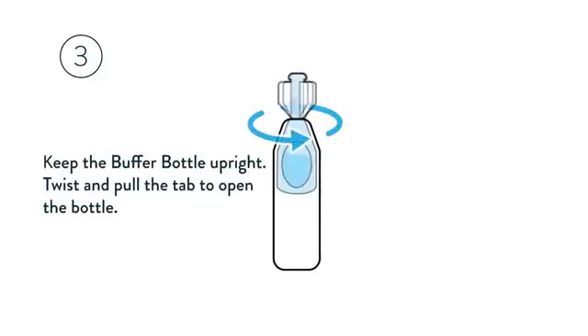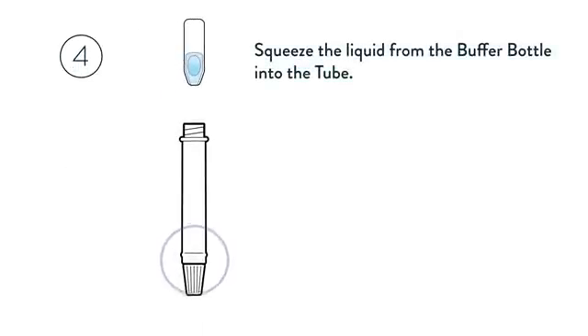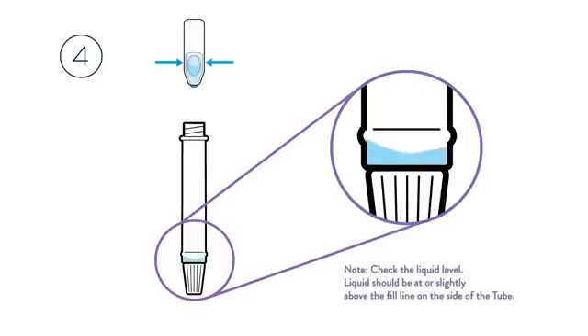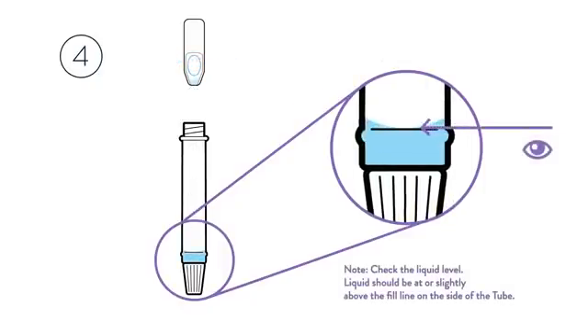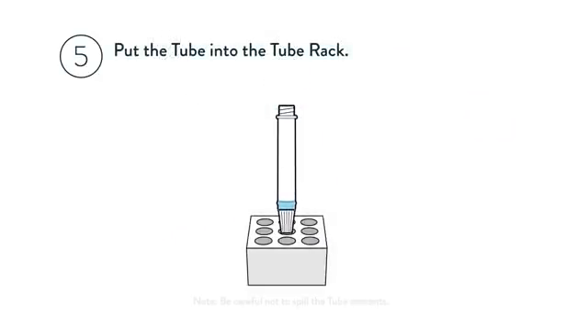Keep the buffer bottle upright. Twist and pull the tab to open the bottle. Squeeze the liquid from the buffer bottle into the tube — you will need to squeeze at least twice. Check the liquid level; it should be at or slightly above the fill line on the side of the tube. Put the tube into the tube rack, being careful not to spill the contents.